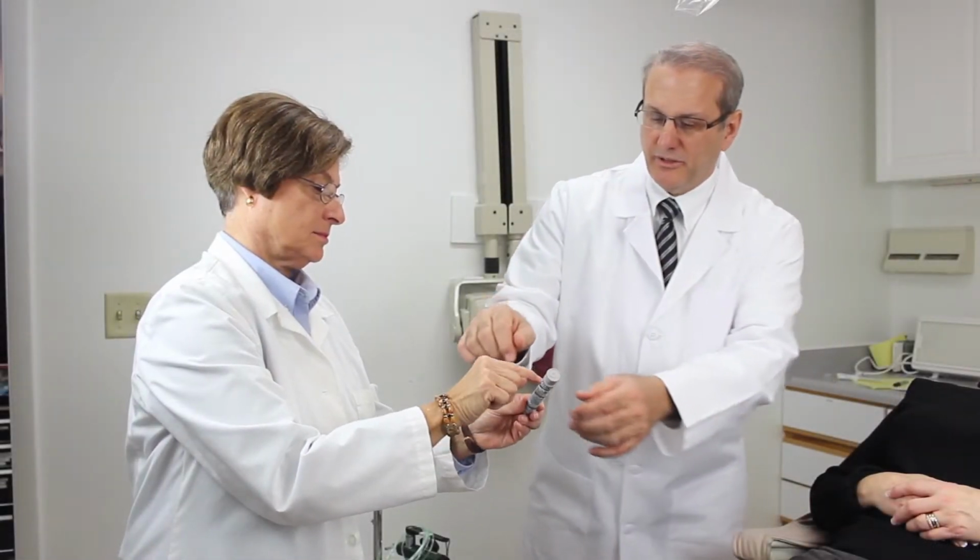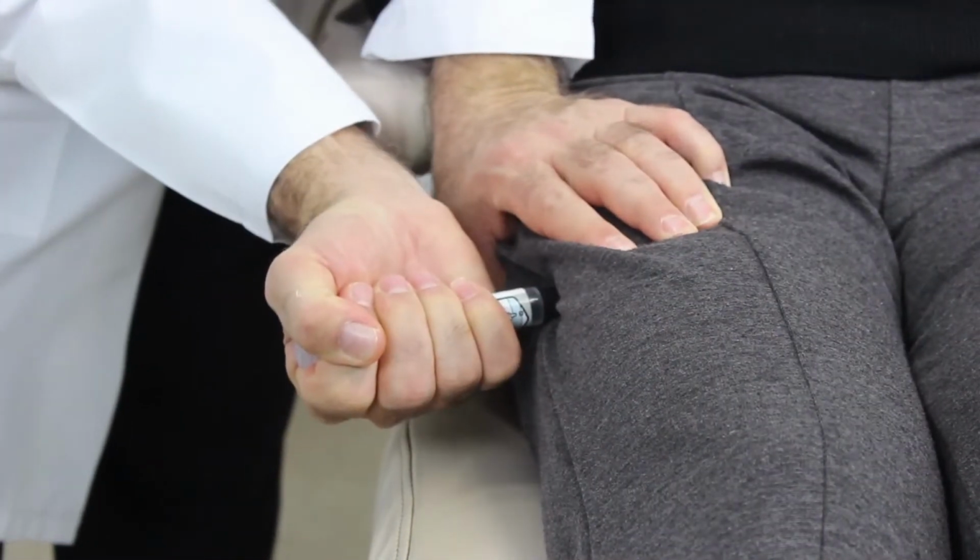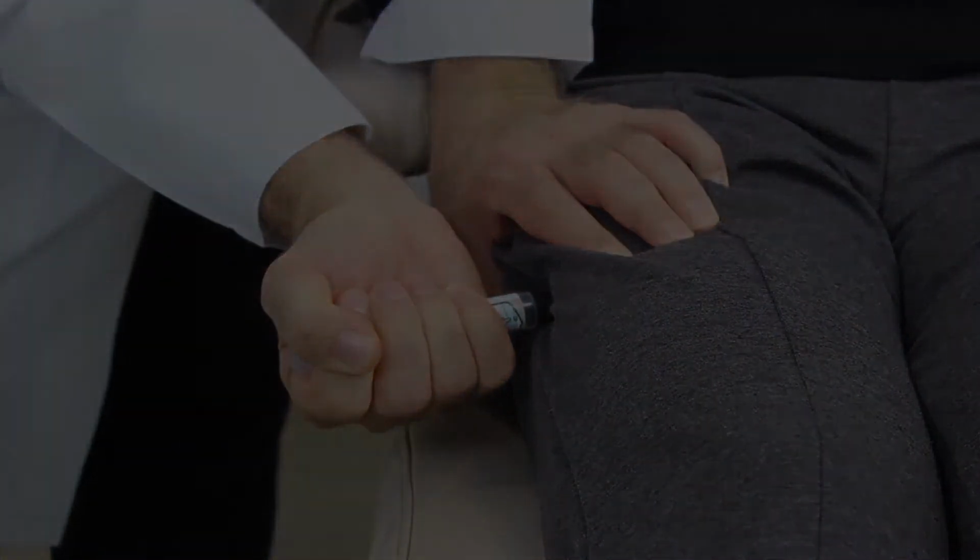Let's do my PABCs again. She's conscious, but she's not breathing well. She seems to be struggling, and I hear some wheezing. It appears that she's having an anaphylactic reaction. Assistant number 2, please give me the adult EpiPen, and please call 911. I will inject 0.3 milligrams of epinephrine in the right thigh.